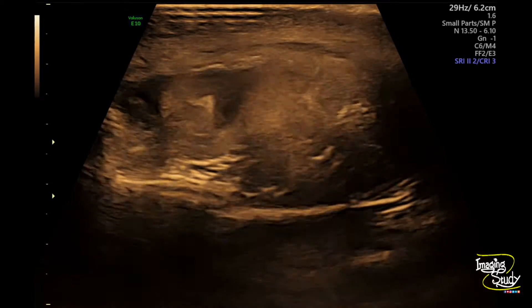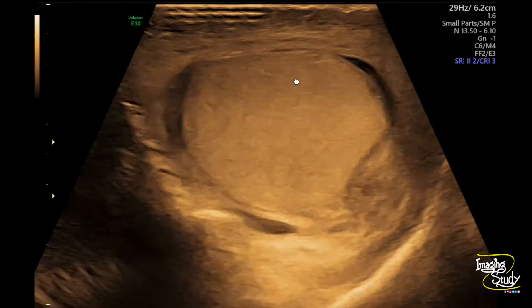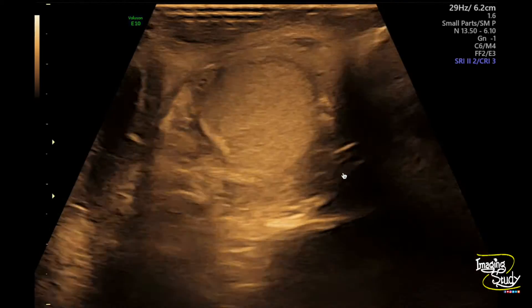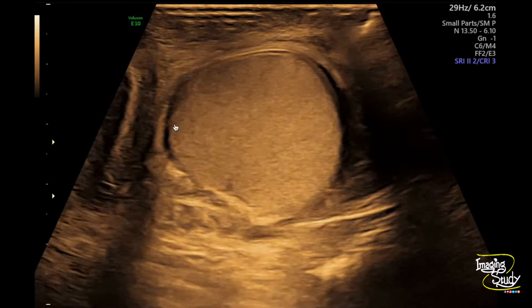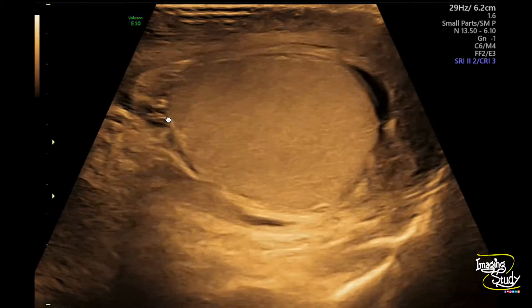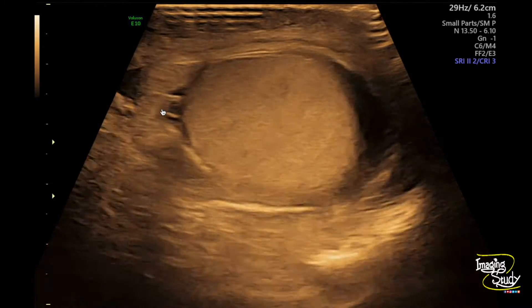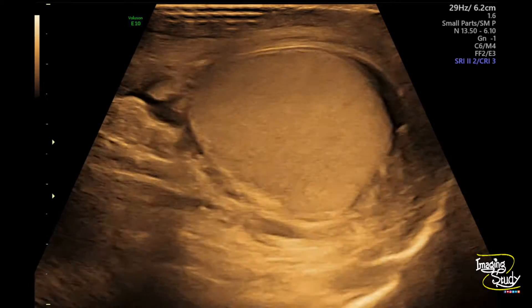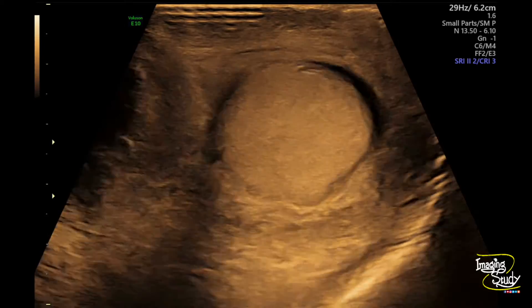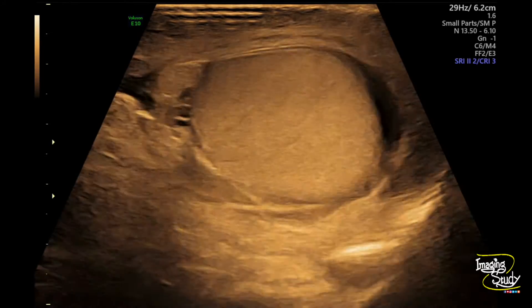Here is the left testis in comparison to the right one — it looks quite normal. You can see the epididymal head here, but the whole of the epididymis that we saw on the previous image is not like this one.